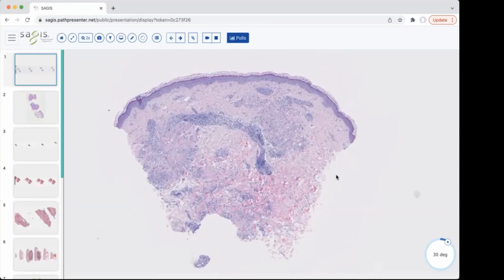This is truly a low power diagnosis. So if the resolution is a little bit low quality on these slides, I'm sorry, but that can actually be helpful for granulomatous inflammation. So this one is a punch biopsy. I think at the low power, you can appreciate that there's somewhat of these circular or ring-shaped collections of histiocytes, potentially surrounding something in the dermis here. There's this big swath of lymphocytes here, but the majority are these paler cells that you can see at low power sort of make up these groupings.